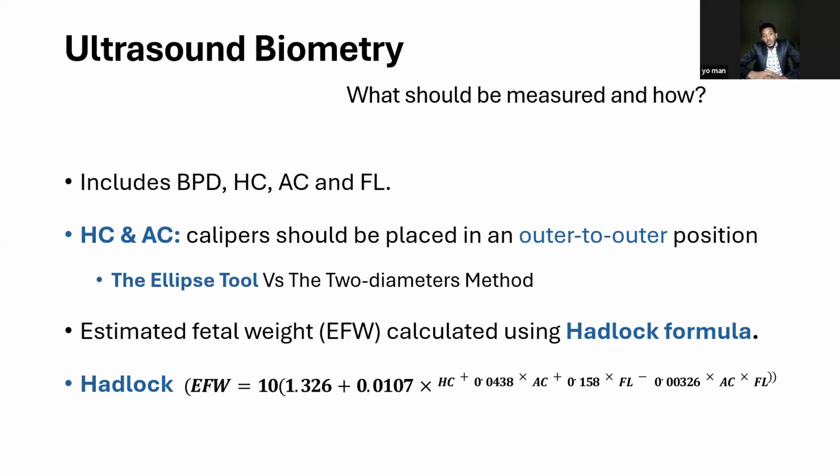The other thing, when you measure all those parameters, the estimated fetal weight will pop out, but what I recommend here is to check your ultrasound machine, as a part of quality control, to see which formula your machine uses.